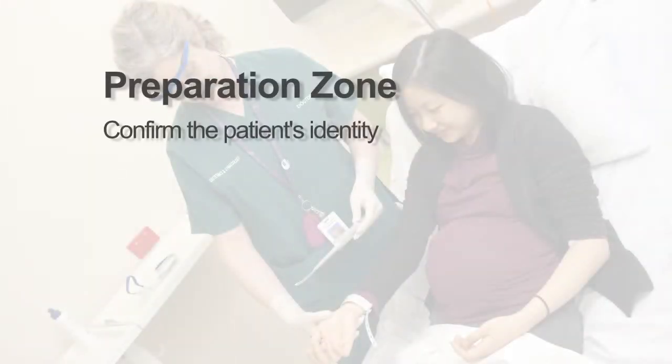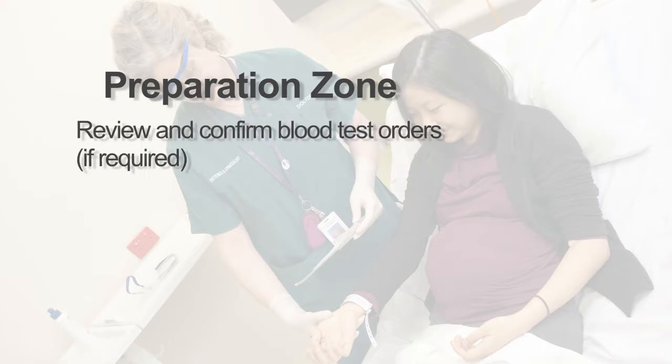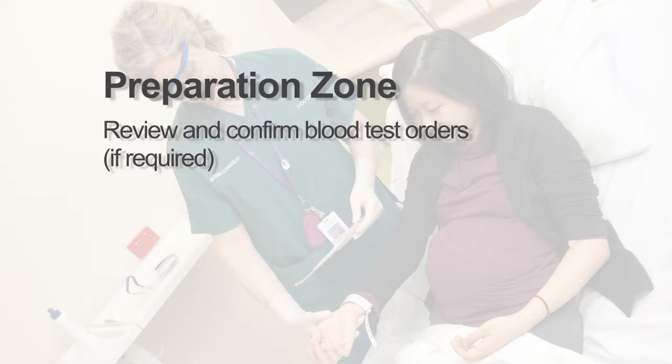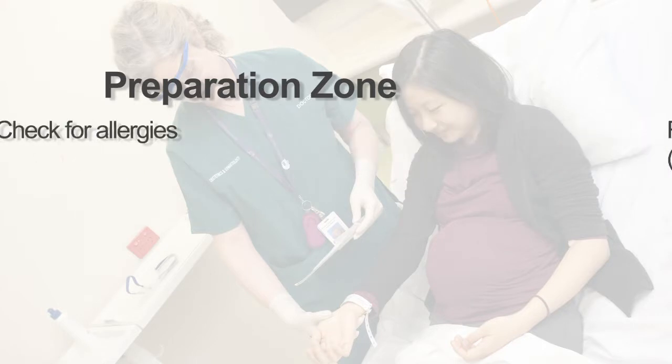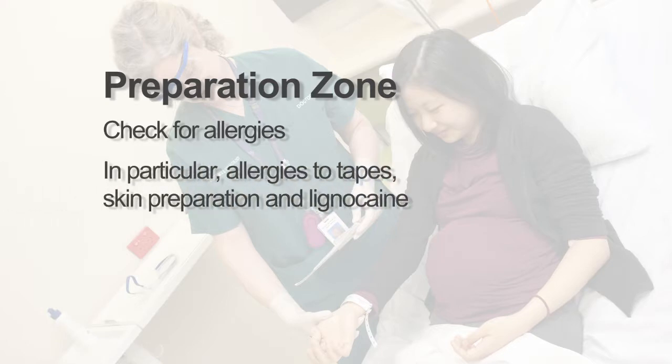Confirm the patient's identity. Explain the procedure to the patient and gain verbal consent. Review and confirm blood test orders. Check for any allergies, in particular allergies to tape, skin preparation and lignocaine.